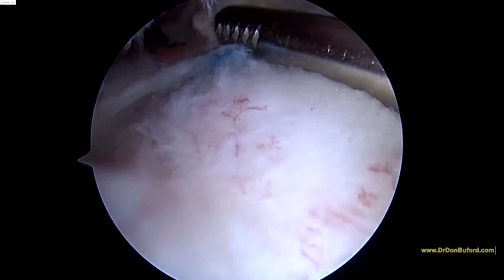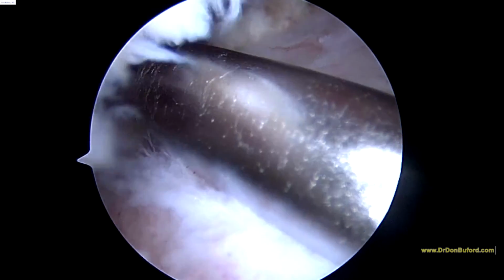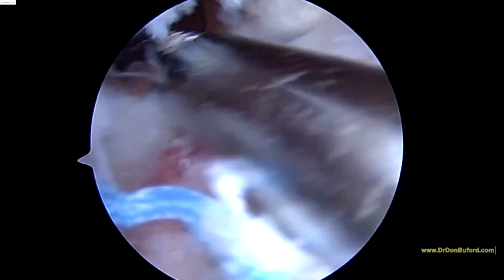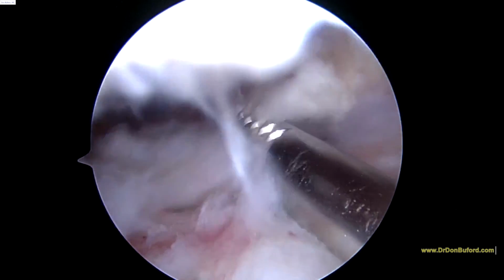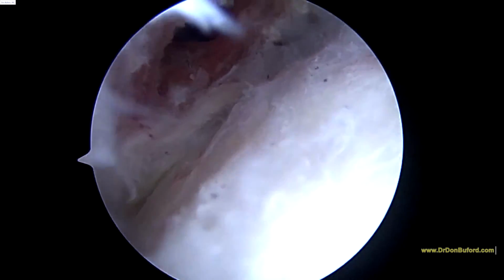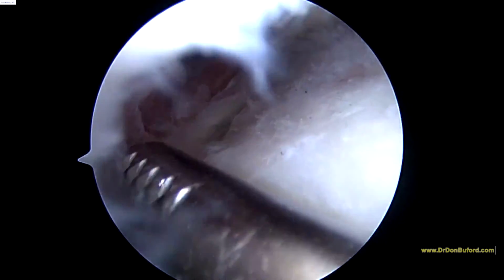Yep, go ahead. Which way are you going? With your external? So go ahead and go external now. So now this is the anterior portion of the cuff with external rotation. That looks good. Let's go ahead and come back in internal. And all along the rotator cuff here, this all looks solid.